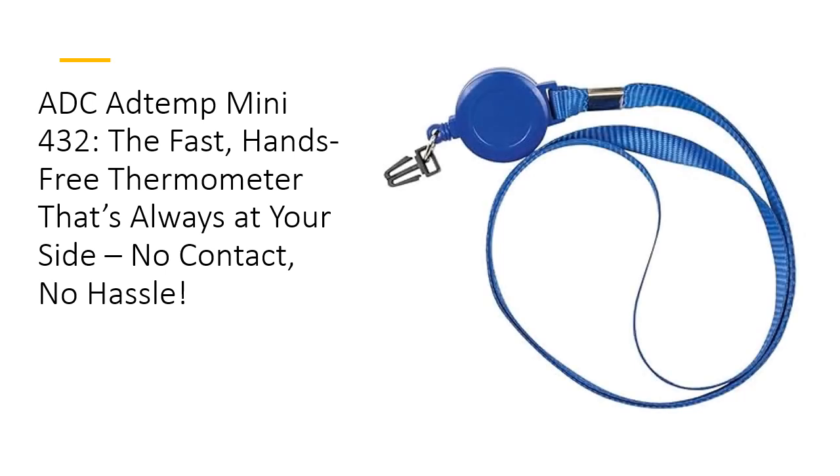The AddTemp Mini 432 isn't just fast — it's built for long-term reliability. This thermometer features a rechargeable lithium-ion battery with up to 1,000 readings per charge and an incredible lifespan of 300,000 measurements. Unlike disposable models, it's ready for years of dependable use. With its durable, ASTM-standard design, this thermometer is an investment in quality you'll never regret.